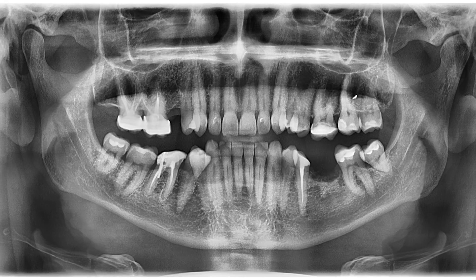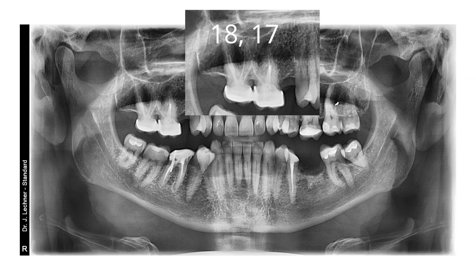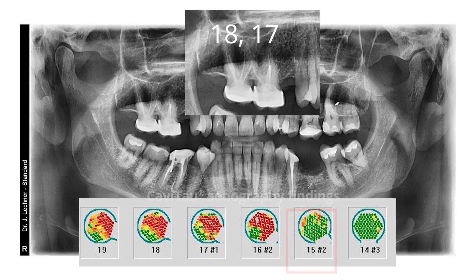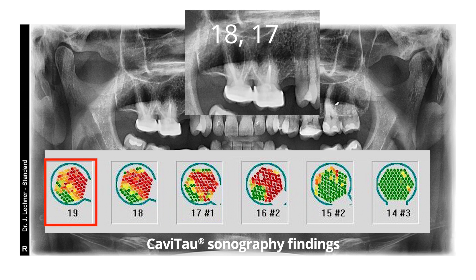The x-ray shows the root-filled teeth 1-7 and 1-8 in the upper jaw on the right without diagnostic findings. In comparison, at the bottom of the image, the display of the cavital measurement: the healthy tooth 1-5 is shown in green and therefore not suspicious. In contrast, the bony areas of teeth 1-7, 1-8 and also the retromolar area 1-9 show clear red colouring with suspected fatty degenerative osteonecrosis.